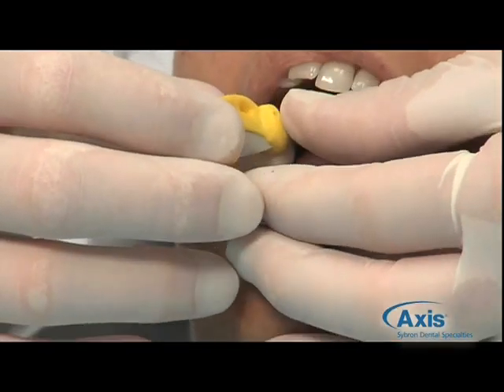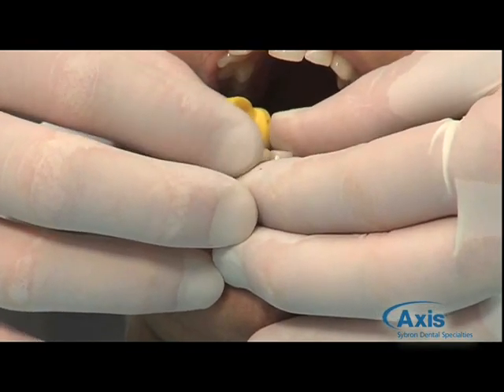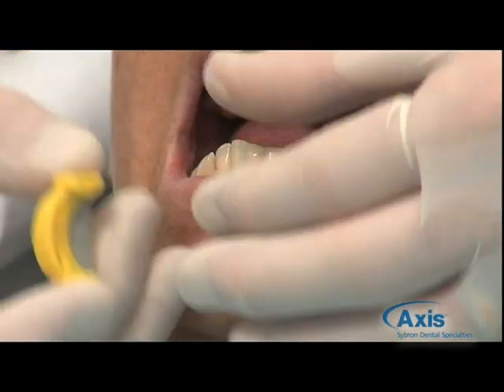We're going to take that Quick Strip, slide it down between the teeth, and then work it back and forth to restore that contour, that nice round edge that it originally had.